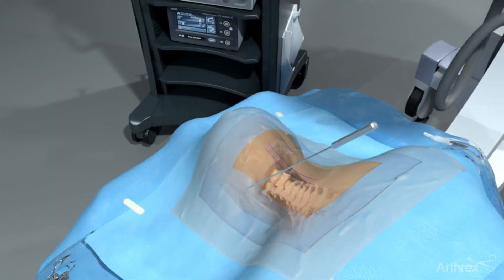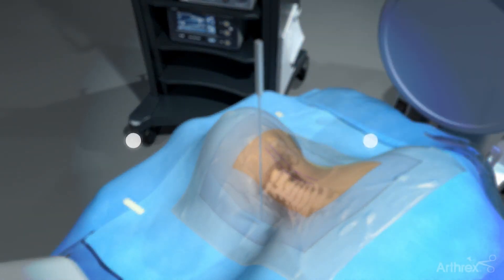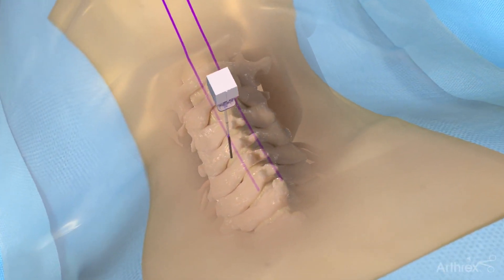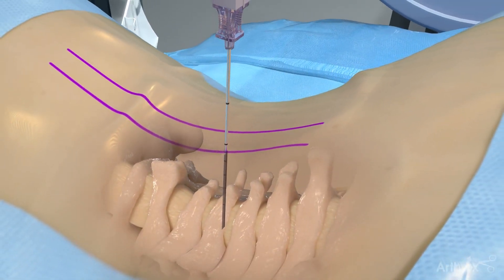A C-arm is used to verify the correct level or levels being treated using both AP and lateral fluoroscopy. Insert an introducer needle one centimeter lateral to midline. Palpate the upper lamina using the needle.